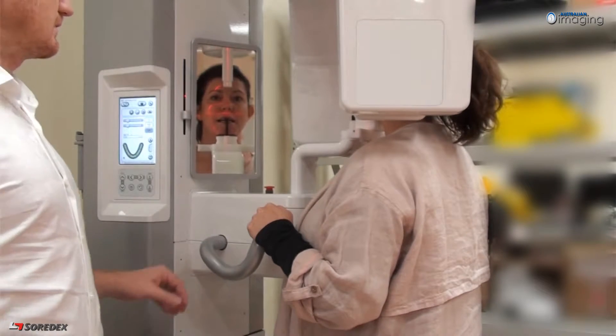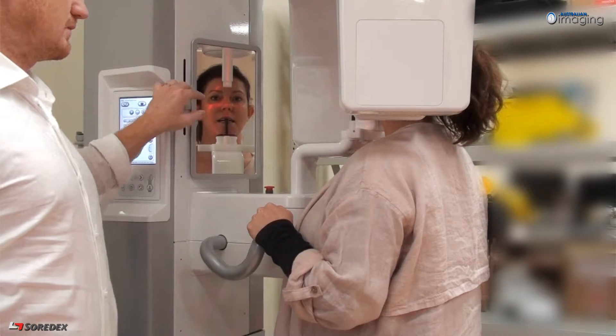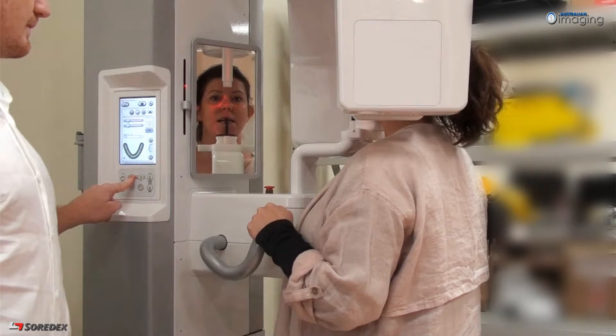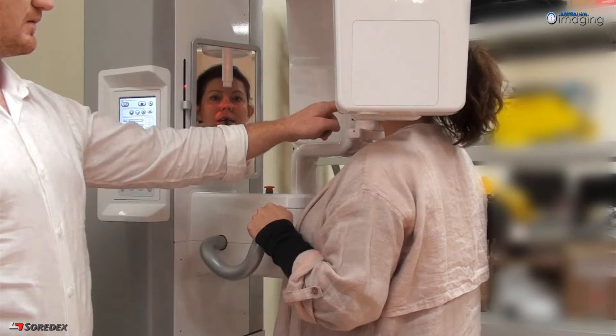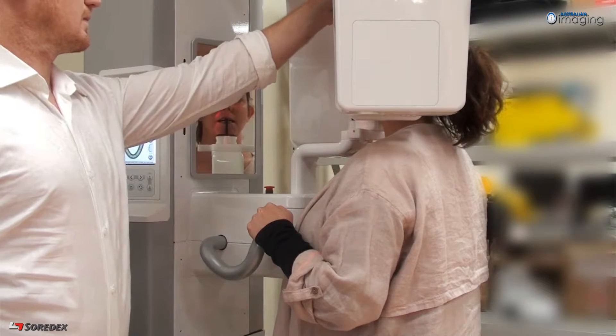Using the screen controls, position the patient so the horizontal Frankfurt plane is aligned from the infraorbital notch to the tragus of the ear, and so that the vertical plane bisects the canine. Next, check the centrality of the beam by ensuring the mid-sagittal light aligns with the mid-sagittal plane of the patient.